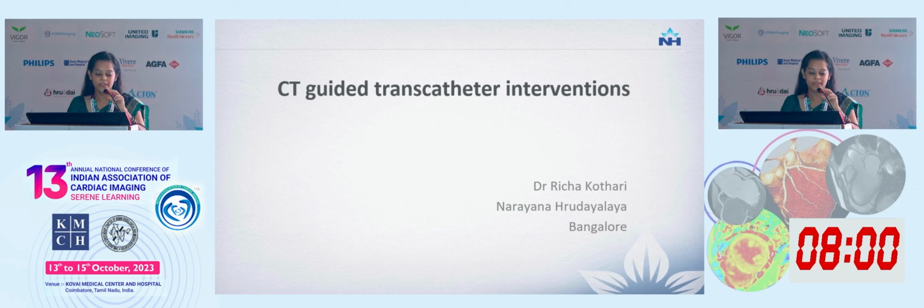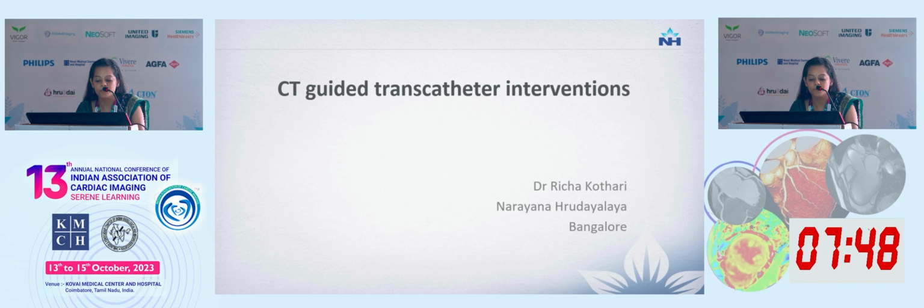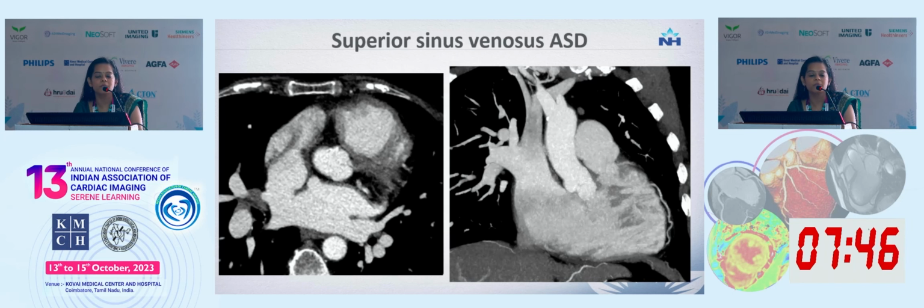I would like to present a new thing which we've been doing in the last year. There are a couple of cases where we've done some CT-guided transcatheter interventions. One of them is in superior sinus venosus ASD.